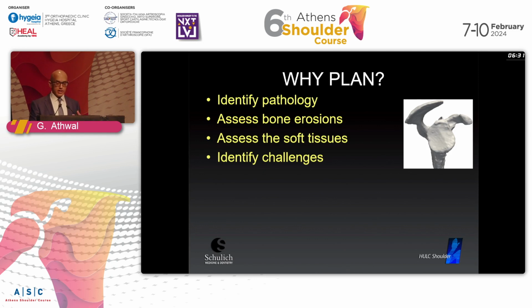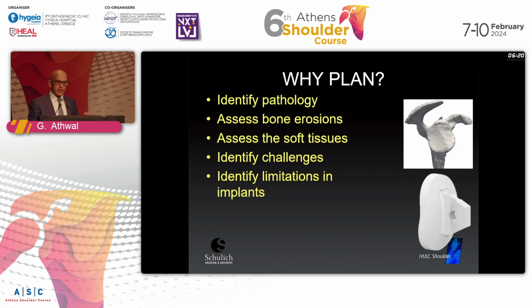Identifies the challenges. If I choose to do an anatomic in this patient with a B2, I'm going to have to address that bone loss. I'm going to have to address that subluxation. And these are challenges that I'm going to have intraoperatively. And it also allowed me to identify the challenges or limitations in the implants I have available.